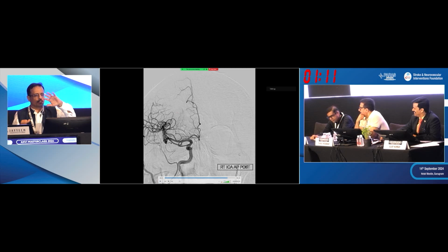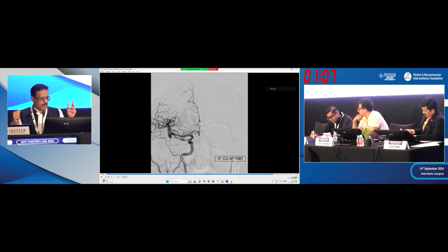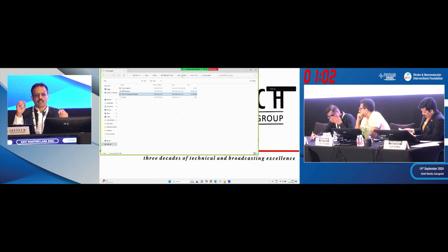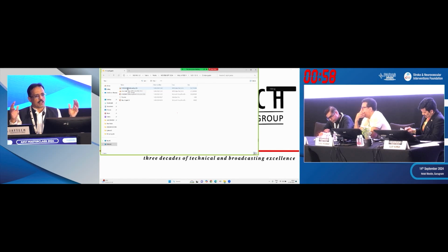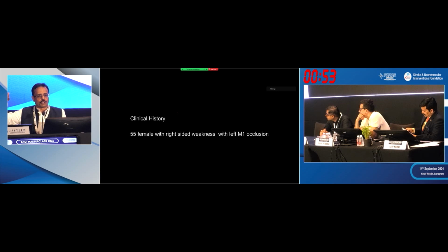Yeah, just to show the crowd, I mean other people, that yes, there are situations where we have to be stenting, and what approach we take in these cases: balloon guiding, initial aspiration maybe, but under balloon guiding aspiration. We love to use wall stents because they can be, even Rene Chapeau has shown he takes wall stent up to the petrous ICA as well, and these are much cheaper than trying to use our neurostents in these kinds of situations. Now, we went from tandem to dissection, and one comment from Vincent about the technique in dissection.